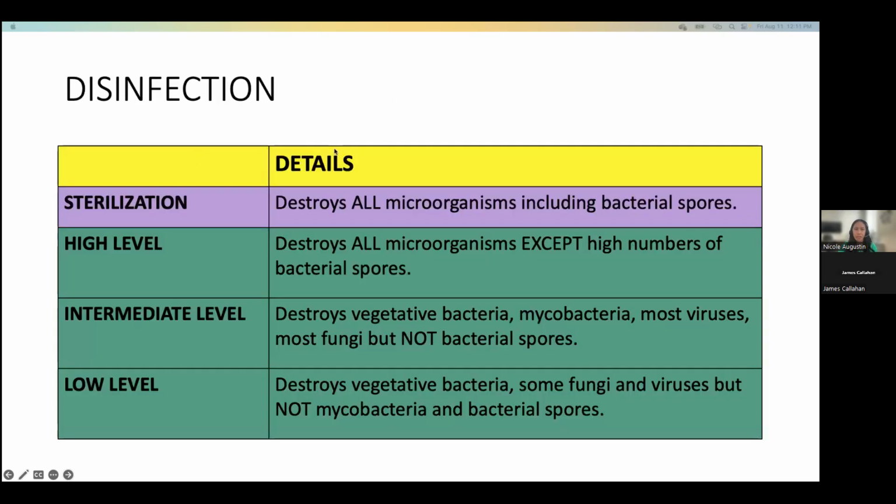Here I have a table that explains details of sterilization. Sterilization destroys all microorganisms, including the spores. When you get to the disinfectant, this is where you differentiate the spores. With high level, you destroy all microorganisms except a high number of spores.